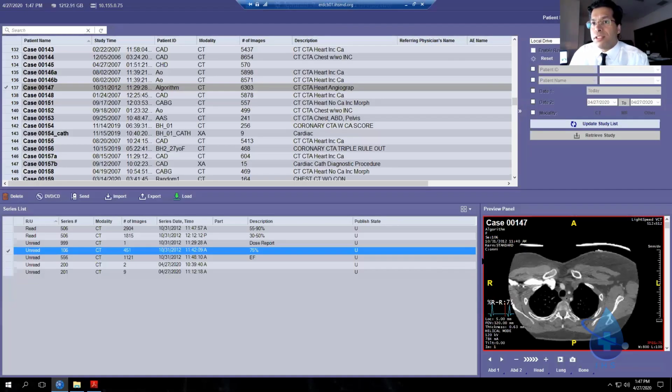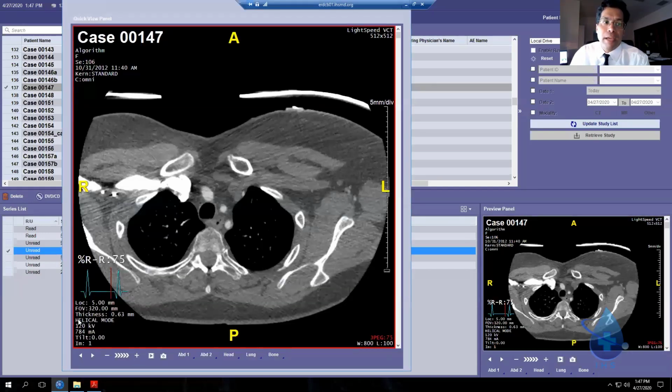The radiation dose delivered to the patient is actually, there are two stamps in every image. The FDA requires that the kV setting on the CT scanner and the mA setting be stamped into the image. kV is the voltage and the mA is the current across the CT scanner plate. The bottom line is adjusting the kV will exponentially increase or decrease the radiation dose delivered to the patient. Adjusting the mA is fine control and will only linearly drop or increase the radiation.